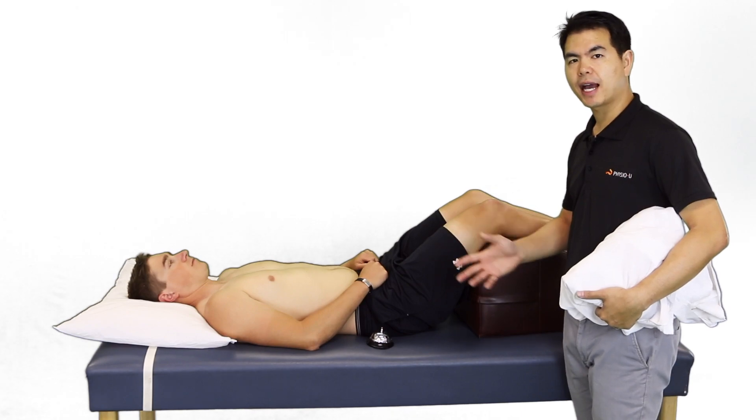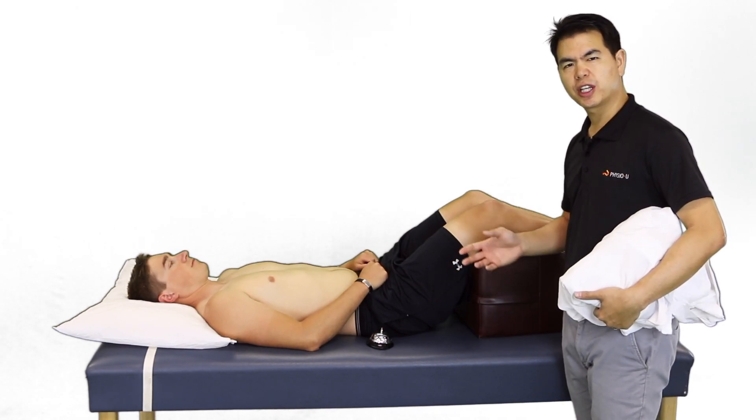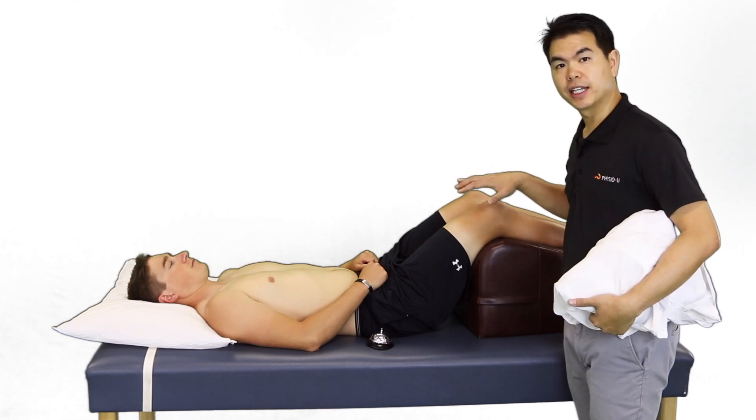Before applying an ice pack or a cold pack, you want to ensure that there's no jewelry or clothing obstructing the area.